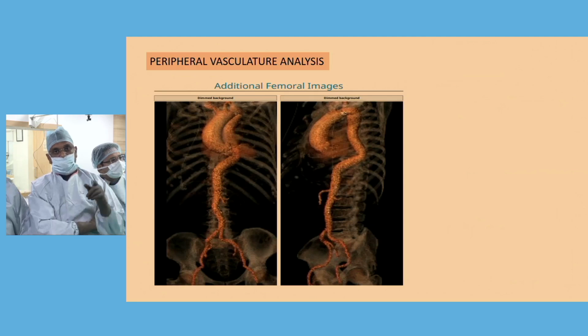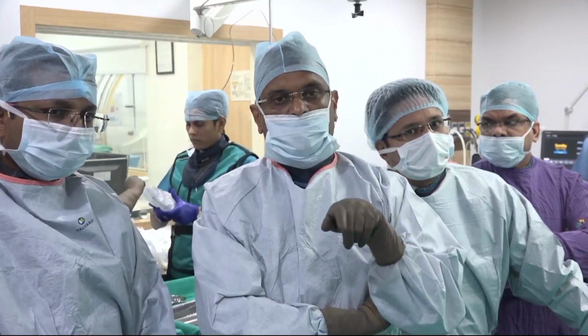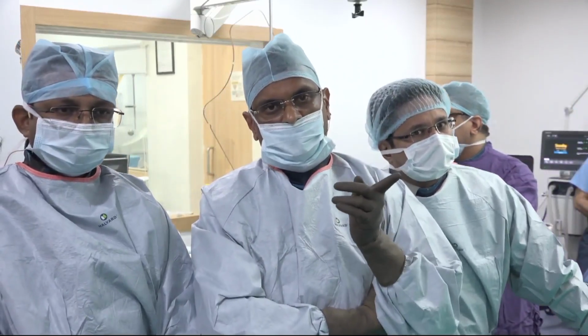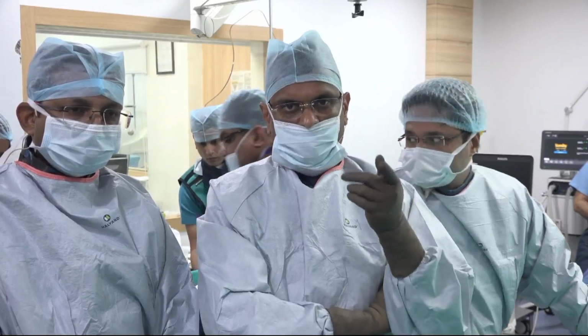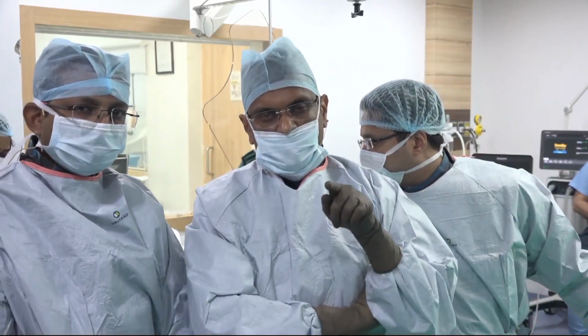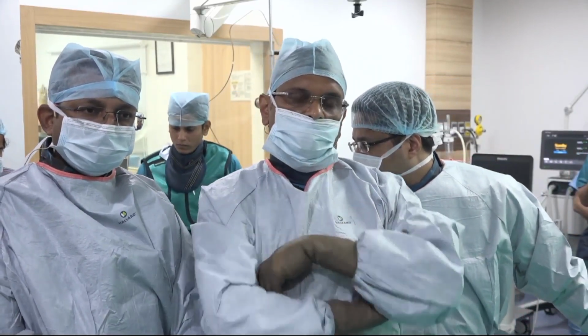But you should also keep in mind that there is a huge chunk of calcium, and the calcium runs into the LVOT, particularly if the calcium runs at the site of NCC, RCC, then the chance of pacemaker is very, very high. So though we predict a very less chance of pacemaker in this case, still we cannot negate it completely. So what we are going to do is we are going to take the left puncture.